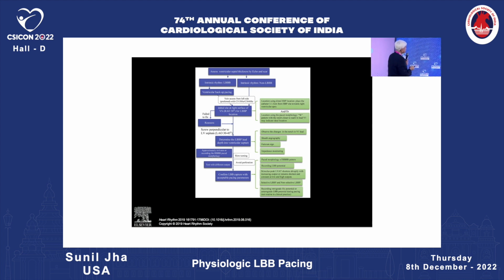Then the most important part is, are you capturing the conduction system or not? So assess the ventricular septal thickness by echocardiogram or scar. We don't do it routinely though. And then the initial site is the right surface of the ventricular septum.